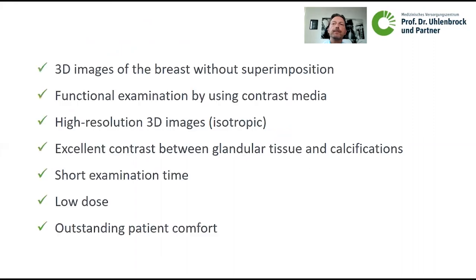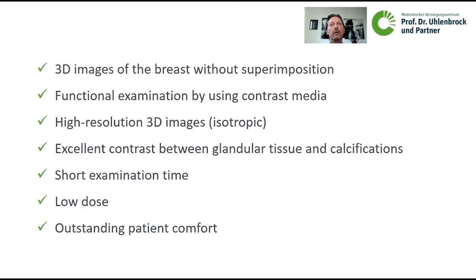Conclusion: from a technical standpoint, the MAMA CT provides 3D images of the breast without any superimposition. With contrast media, it offers functional examination of the breast. We have isotropic images with an extremely high resolution of up to 0.15 millimeters, excellent contrast between glandular tissue and calcifications, a short examination time of about 12 seconds per breast with a full examination in five to seven minutes, an extremely low dose, and outstanding patient comfort.